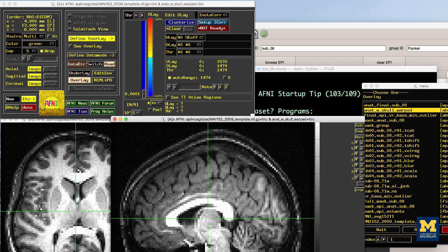The ANAT_w_skull_warped image, it should be noted, is the result of a warp being applied to the raw anatomical image. The warp itself was computed by normalizing the skull-stripped anatomical to a template. If that normalization was off somehow, it would have propagated to the other images. To check this, load as an underlay the image ANAT_final.